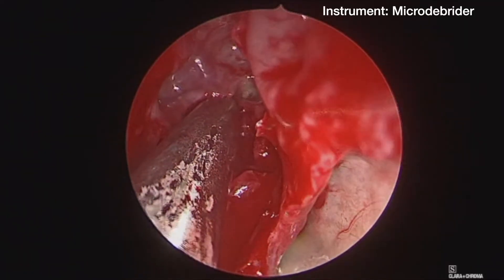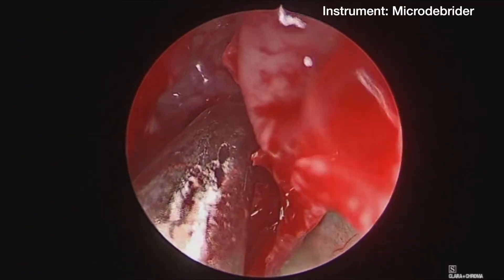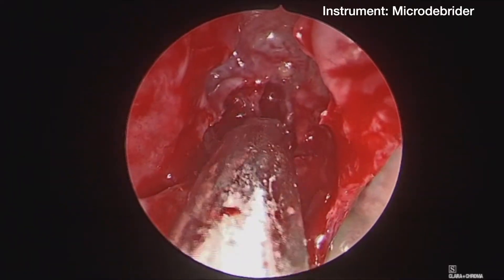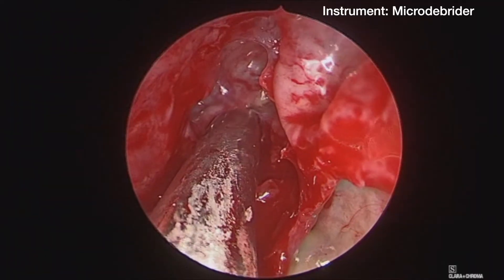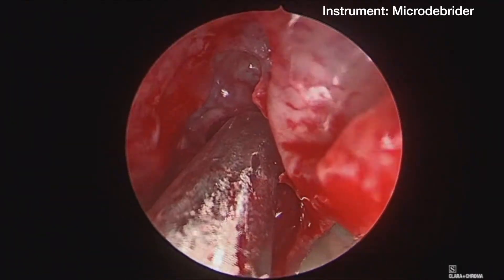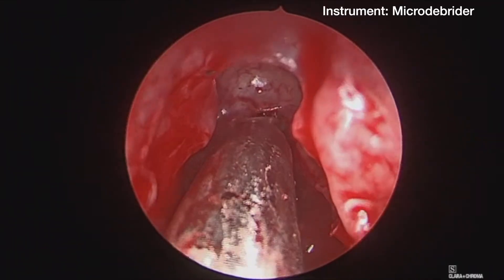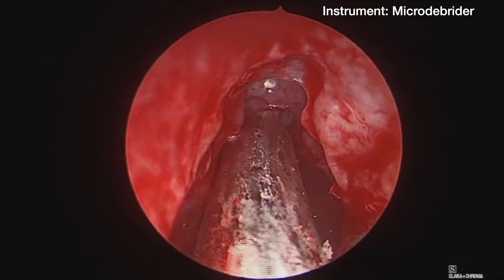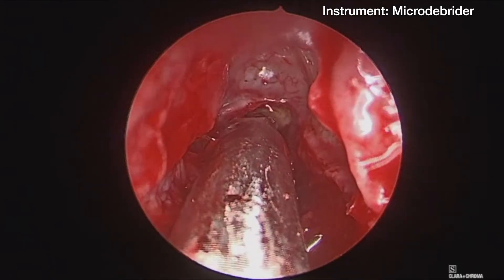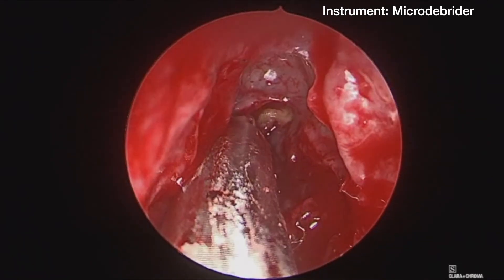The frontal sinus outflow tract is further expanded using the microdebrider and several small bony septations are removed in order to expand the opening and gain further access to the fungus.